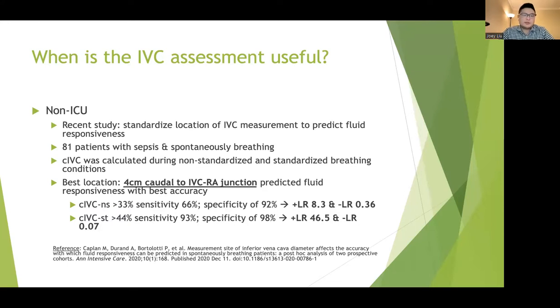They determined that the best location for the IVC assessment is actually 4 centimeters caudal to the IVC-RA junction. They found that in this location, fluid responsiveness was predicted with the best accuracy. They separated their outcomes into CIVC non-standardized, which is the real world scenario, I would say.